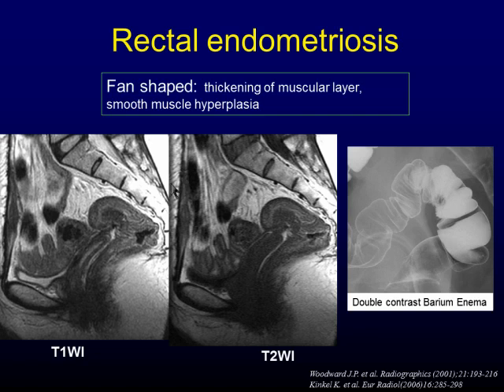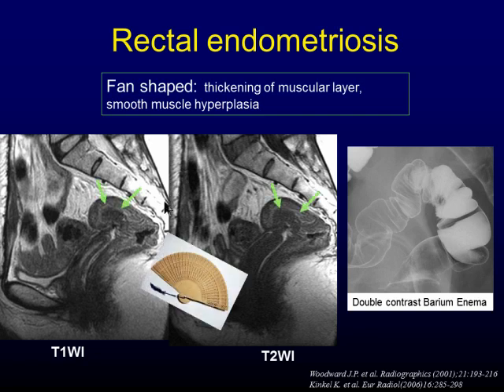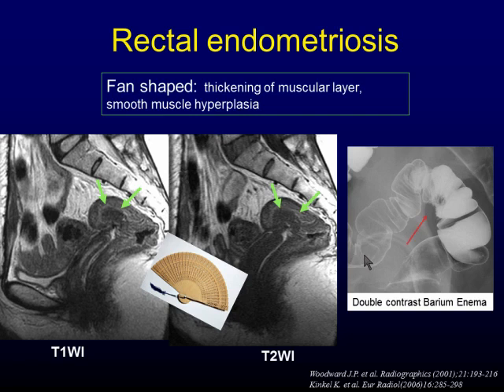The rectosigmoid junction is the most commonly affected area of intestinal endometriosis. The characteristic findings are asymmetrical thickening of the anterior rectal wall, called fan-shaped. This finding corresponds to thickening of the muscular layer and smooth muscle hyperplasia at histology. On double contrast barium enema, an irregular bowel surface with narrowing is shown.